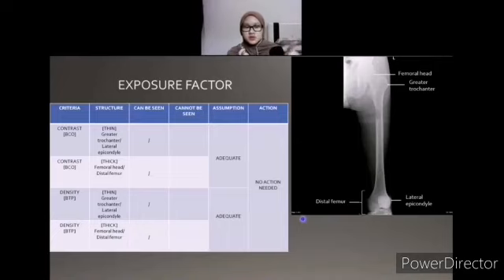And the mAs used is adequate. This is because the bony trabecular pattern of the thin structures, which are the greater trochanter and lateral epicondyle, can be seen, and the bony trabecular pattern of the thick structures, which are the femoral head and distal femur, can be seen. There is no action needed to improve this.